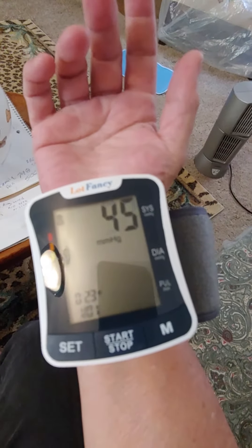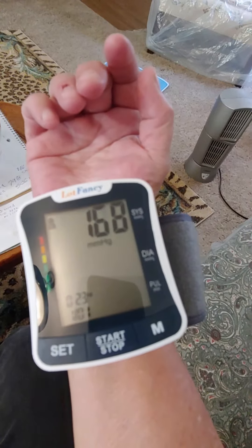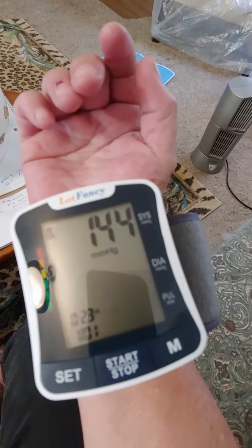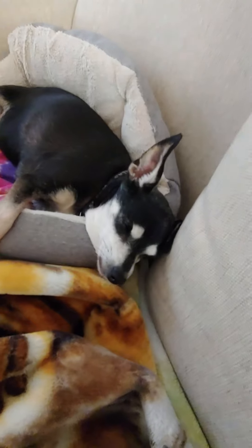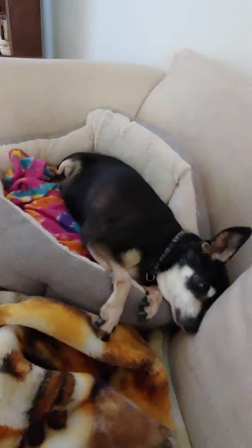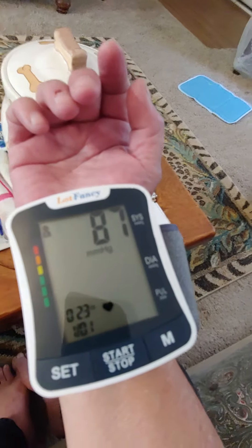See how this works? It's probably going to be low now because I've been laying down for a while. By the way, there's your papa. Papa, say hi, mama. Alright, so here it is.